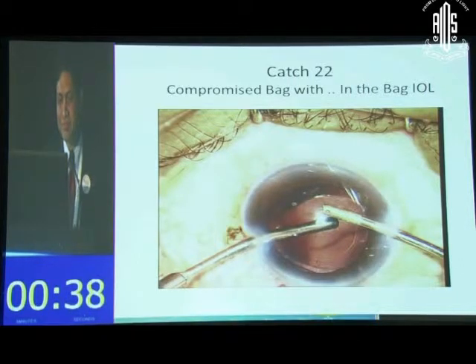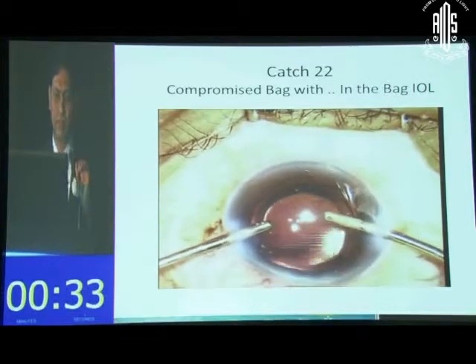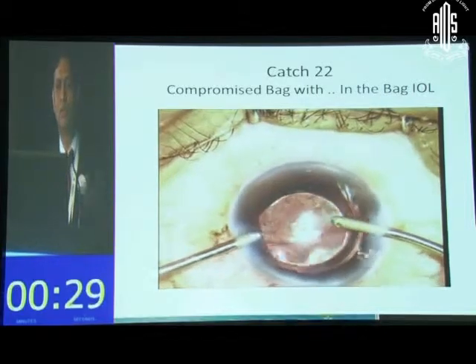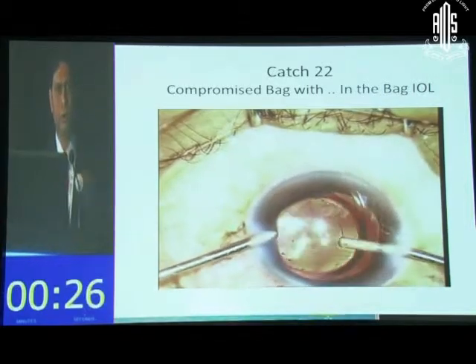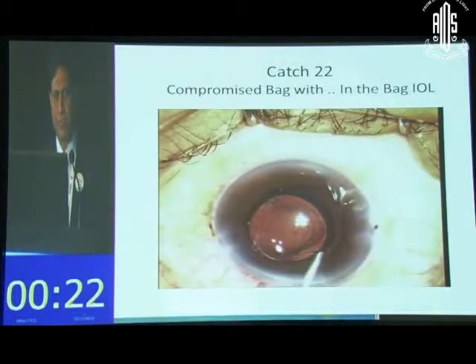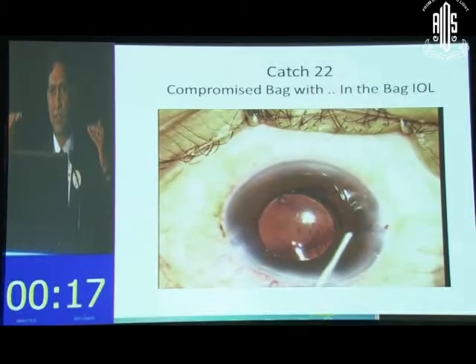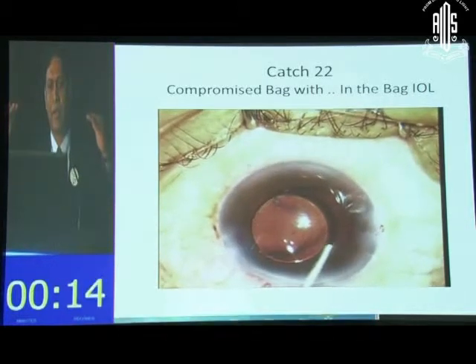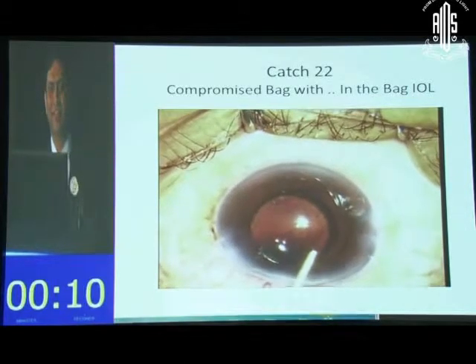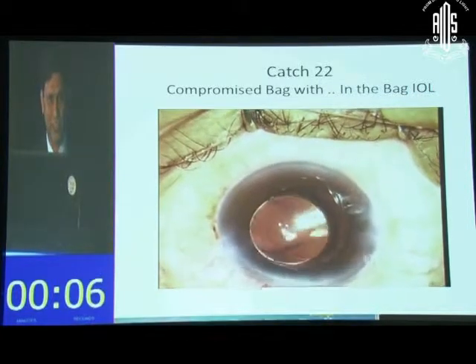So I went ahead. Some of you might think that the easiest solution is to do a reverse capture of the optic, where you bring the optic anteriorly and capture it in the rhexis, because the haptics are already inside the bag. But remember, this is a Technis 1 lens. It's a biplanar lens. The haptics are at an anterior plane compared to the optic. So you just can't do that. In fact, I tried that initially, and I'm not showing that part because I didn't want to show you how foolish I was that day.